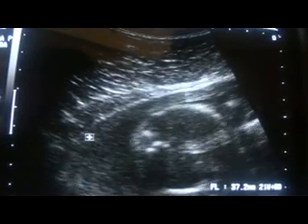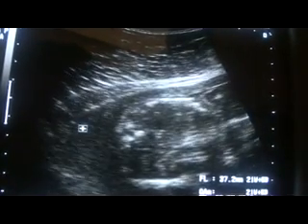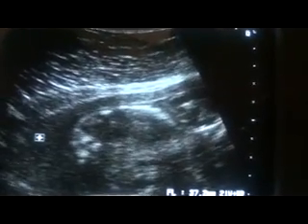Once again, this is the stomach bubble. From this area, we rotate 90 degrees — and here we are. The stomach bubble is used as the landmark, and from here we rotate to get the correct transverse plane of the fetal abdomen.